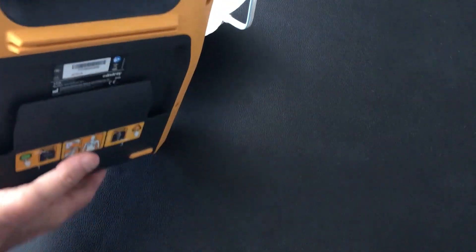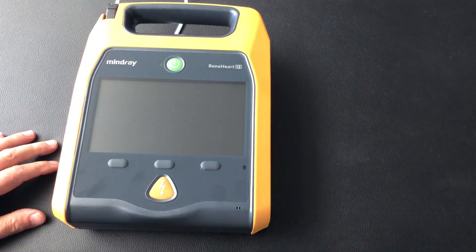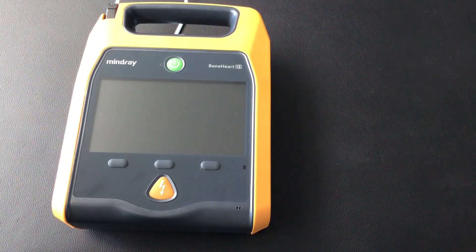Last thing is we turn it over and put the bags and the little pads in the little slot on the back to store them there, ready for use. Now we can put the defibrillator wherever it's going to be. Thank you very much.